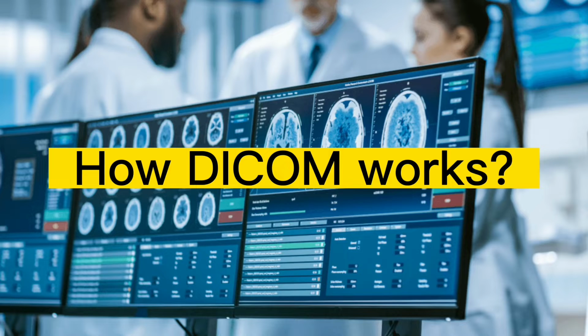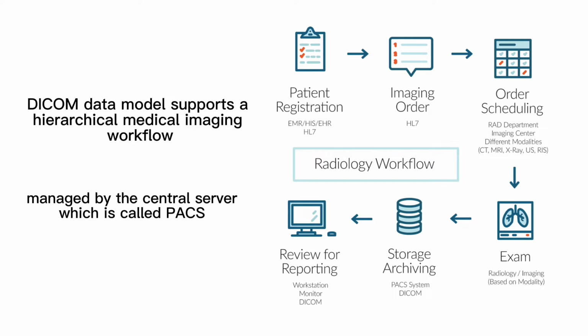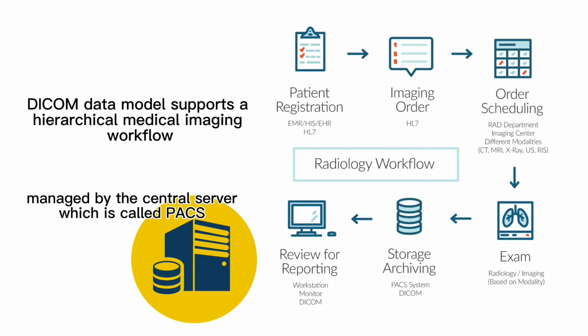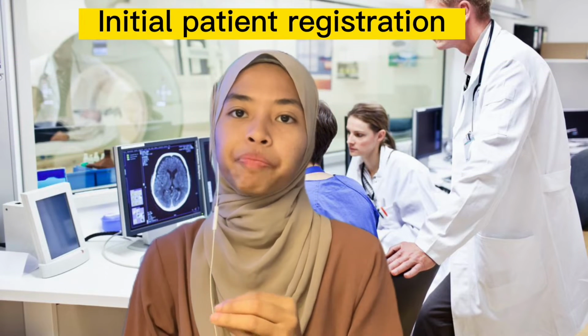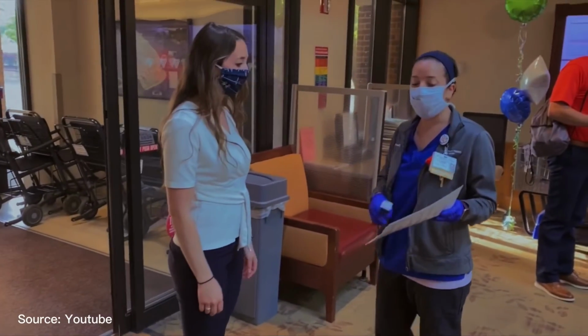You guys must be wondering how Dicom actually works. First and foremost, the Dicom data model supports hierarchical medical imaging workflows that consist of several processes. All aspects of the workflow are managed by the central server, which is called PACS. The first process represents the initial patient registration. Patients usually come to the radiology department as scheduled for their examination. RIS is now updated with the new status of the patient.